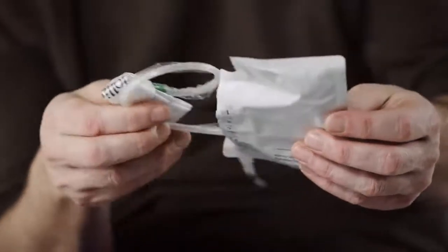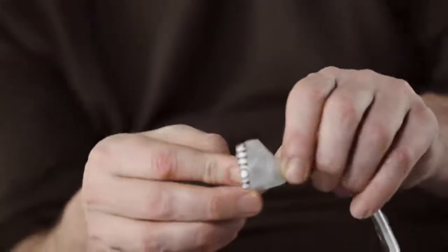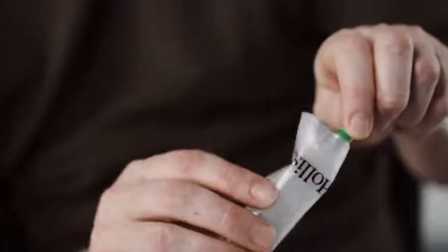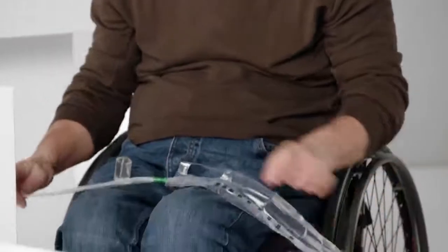If you're using VaPro Plus with an attached collection bag, hold the catheter in one hand while pushing the bag away from the catheter with the other hand to break the paper band. Open it up. Ready?